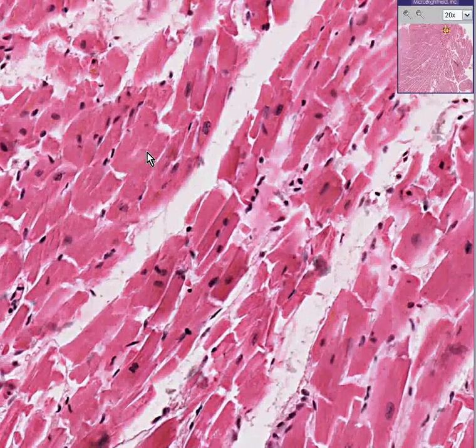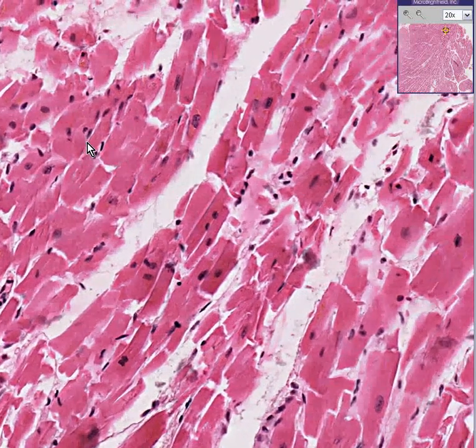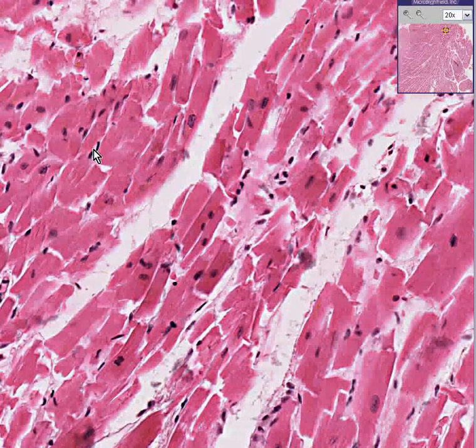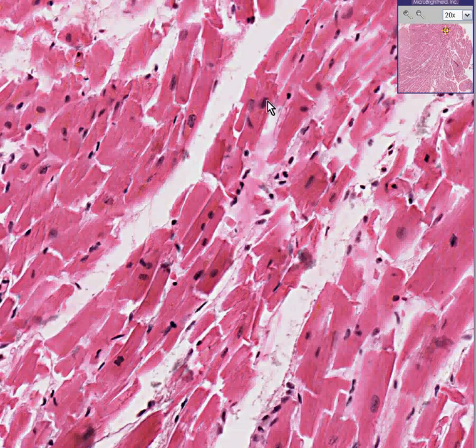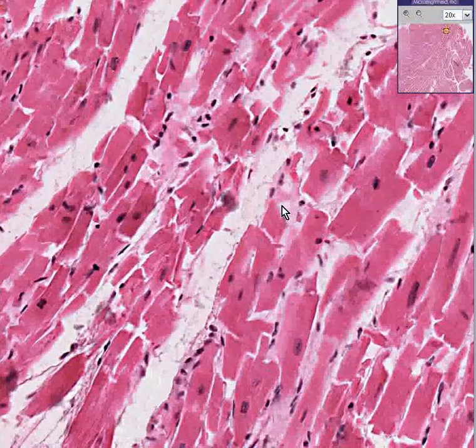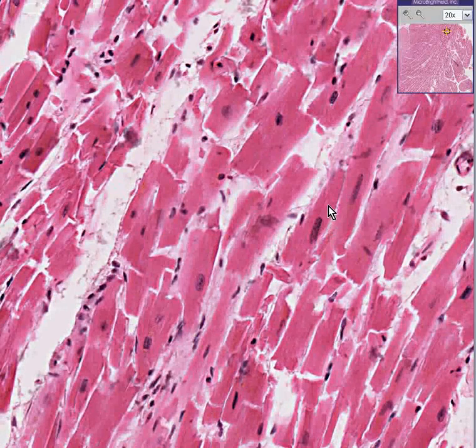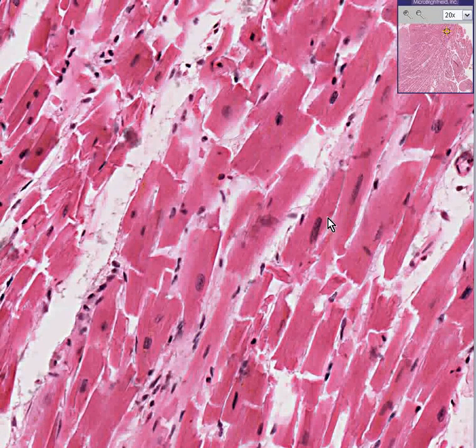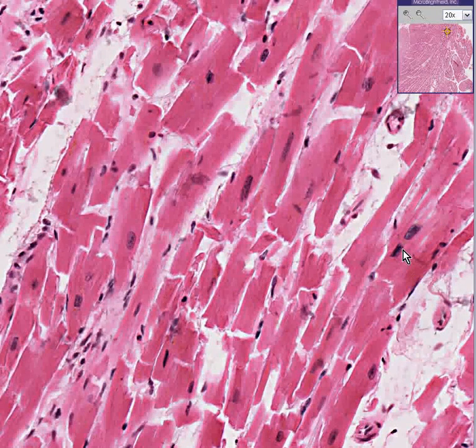One feature of cardiac muscle hypertrophy due to any cause — of which hypertension is the most common — is that you'll get a little squaring off, or what they call the boxcar nucleus. Some of these fibers may be a little thicker than they should be. Not only do they look thicker in terms of size, but you can see some squaring off or boxcaring of the nuclei.